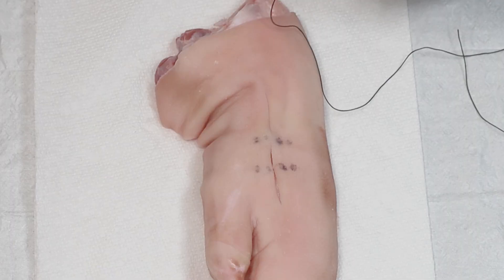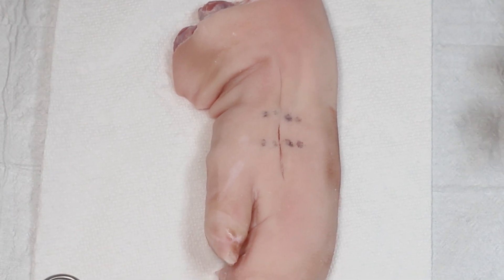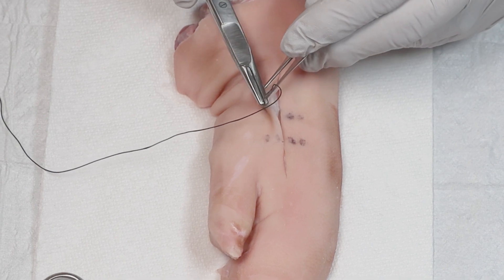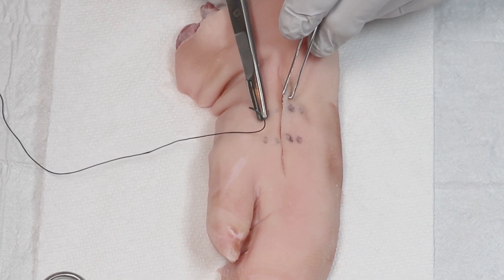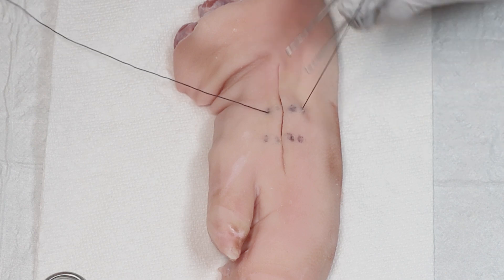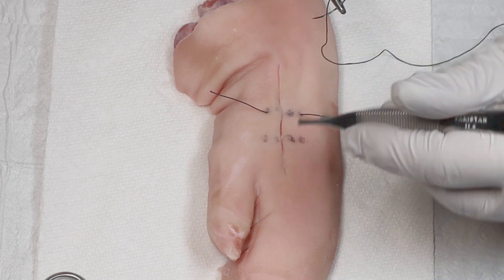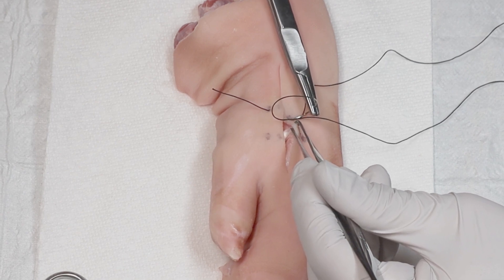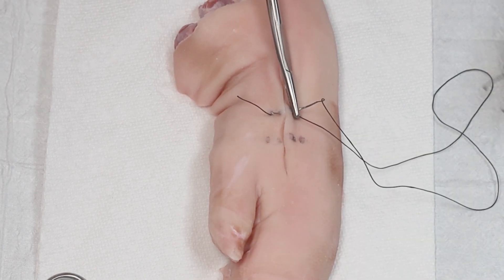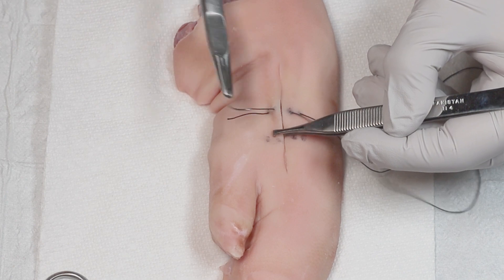The pig's foot is oriented favorably for the camera, not so much for me, but it's important you see this. The vertical stitch is placed in a far, far, near, near order of bites, which is why you may hear it called the far, far, near, near stitch. The far, far loop enters and exits the skin fairly deep at a 90-degree angle, several millimeters from the wound margin. It passes deeply through the dermis. Now we turn our suture needle around, and the near, near loop goes through the skin closer to the wound edge and is not as deep. Now use your instrument tie once you are done placing your needle.